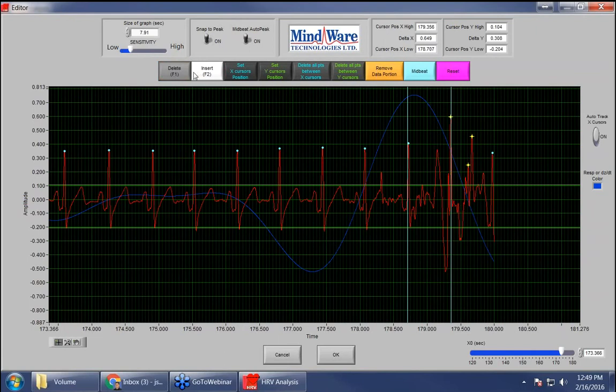And just to show you guys this delete function up here that I'm using, once you click this, you're going to be presented with this little circle, this yellow circle. By moving my mouse wheel, I can actually change the sensitivity on this. So if there were a bunch of points in here, and I'll demonstrate that now, and you wanted to be more precise, you could just snipe individual ones without having to get all of them. And you can also change that sensitivity with this bar right here.